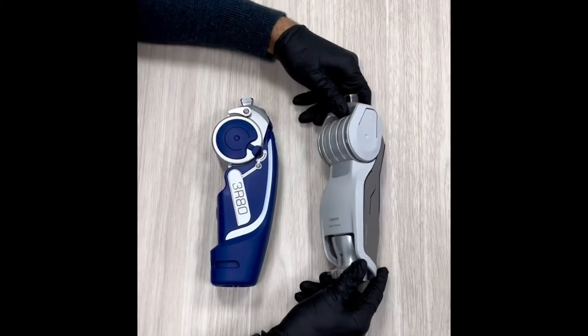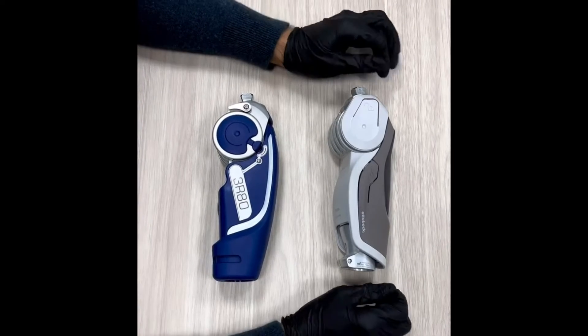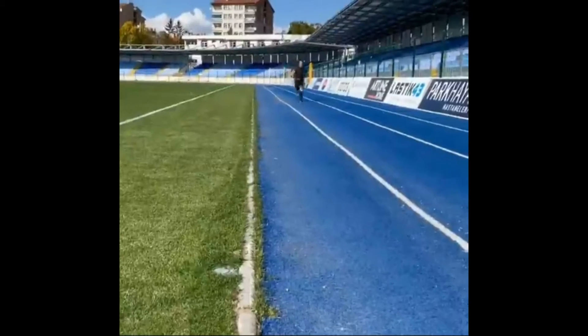The lock keeps the prosthetic knee joint at full extension. This function is suitable for situations where flexion is to be prevented, for example when standing for extended periods of time or wading through water.